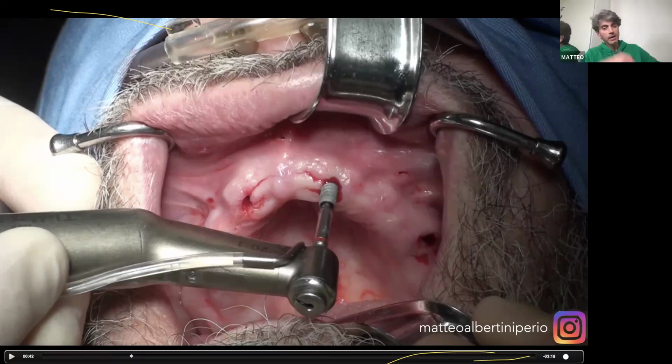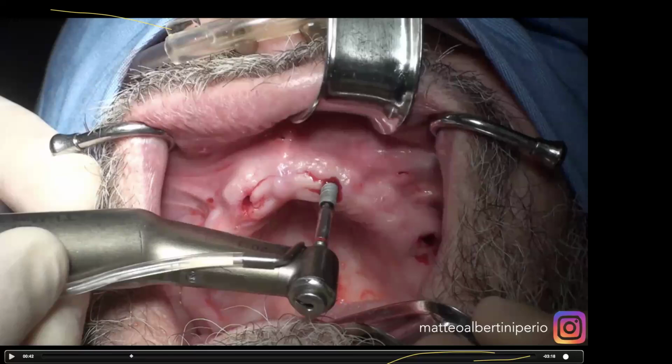And another issue is that with that type of guides, you completely lose the feeling of the implant, which is getting into the bone, and you don't have the right insertion torque. Да, и что интересно, когда мы используем эти хирургические шаблоны, вы полностью теряете ощущение костной ткани, не очень понимаем, какой торк у нас будет у этого имплантата.